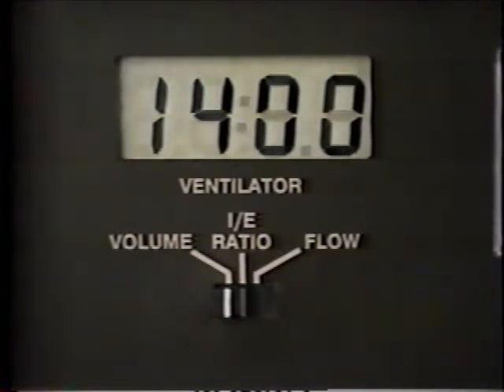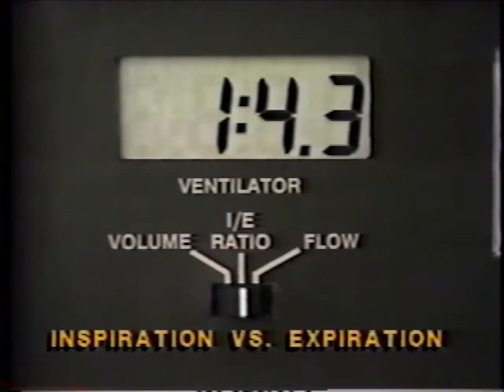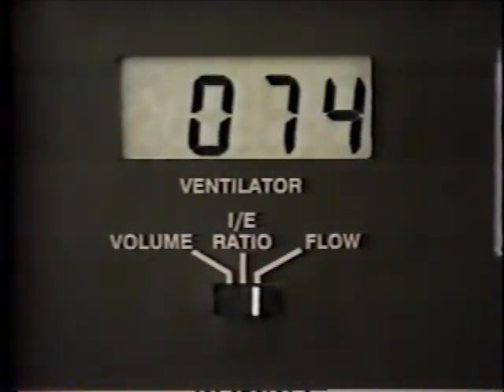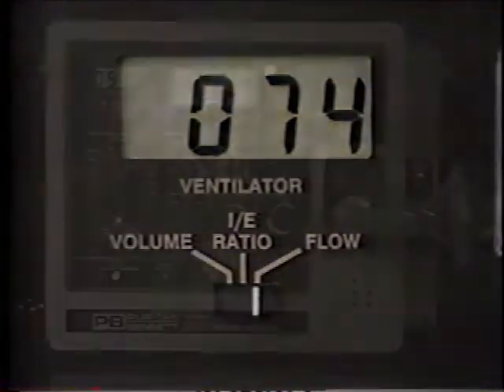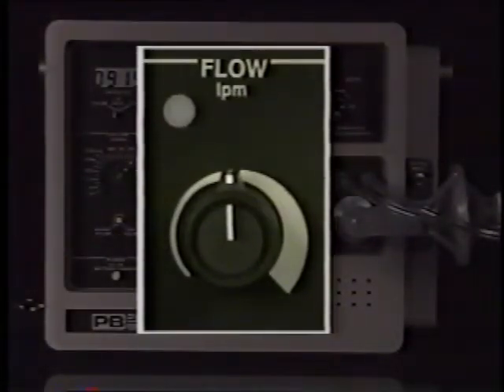The IE ratio position displays the ratio of time devoted to inspiration and expiration for ventilator-delivered breaths. Sigh breaths will be delivered at the same IE ratio as normal volume breaths. The flow position indicates the average flow achieved during a ventilator-delivered breath. When IE ratio or flow are prescribed, move the switch to the appropriate position and turn the flow control knob to obtain the prescribed setting.